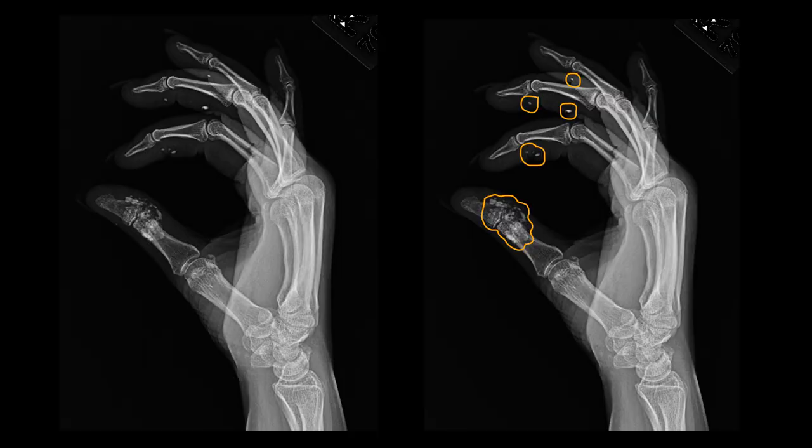On the lateral view of the same patient, we better see the calcifications within the volar soft tissues of the fingers and again see the calcification about the interphalangeal joint of the thumb. This is a patient with scleroderma who has calcification within the soft tissues due to fibrosis, ischemia, and inflammation.